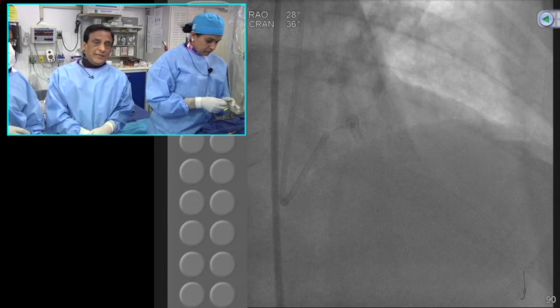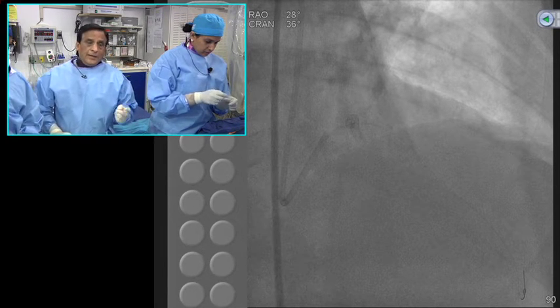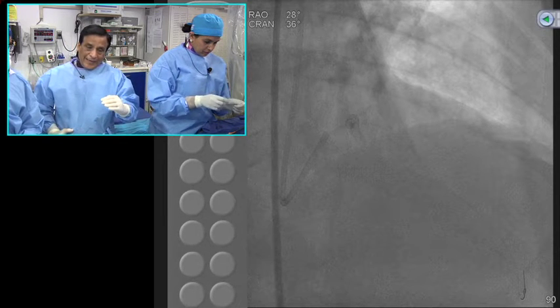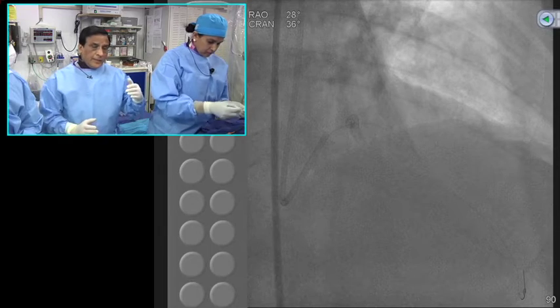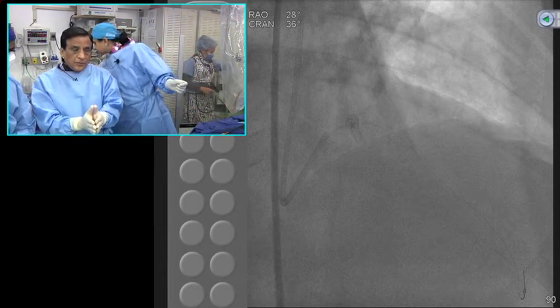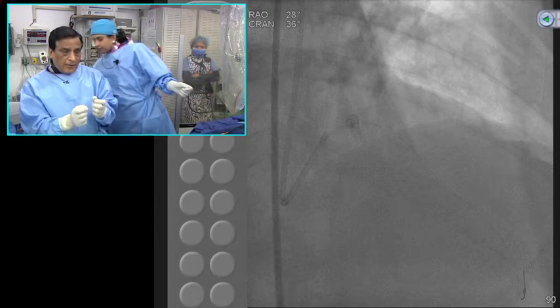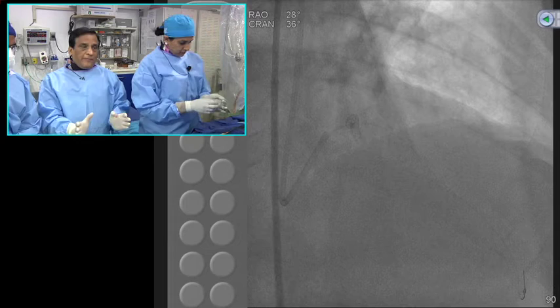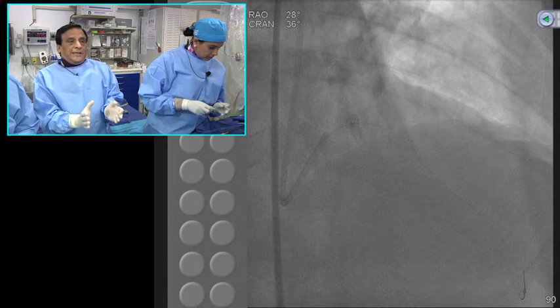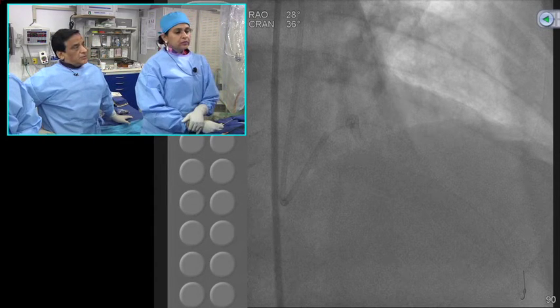Now, what the stent jail wire does, the wire does two things actually. One, the mere presence of the wire makes the angle a little more favorable in terms of the plaque shift, so clearly you have less side branch closure. Second, there is a foreign body in the ostium, so the snowplow effect will not suddenly occlude the vessel because there is additional material, and that will help, in my opinion, in preventing the side branch closure.